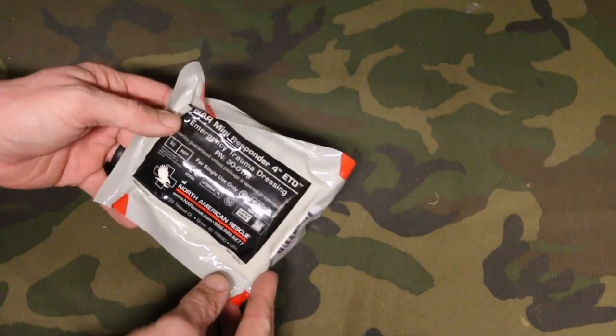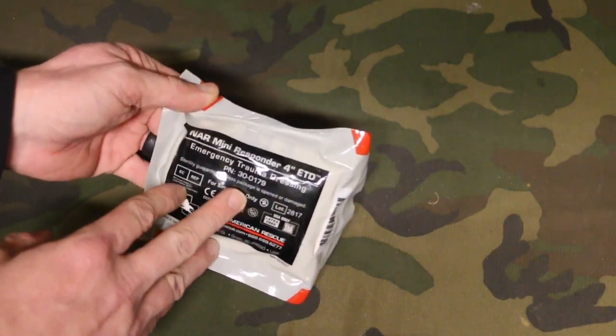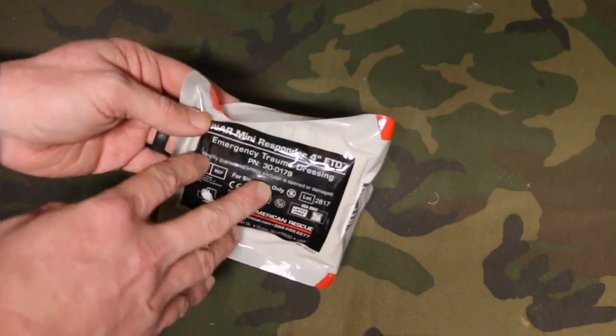Hey, welcome to another video from Medical Gear Outfitters. Wanted to show you a brand new product that we started carrying. This is actually a brand new product from North American Rescue. This is the NAR Mini Responder 4-inch ETD — the Emergency Trauma Dressing 4-inch Mini.